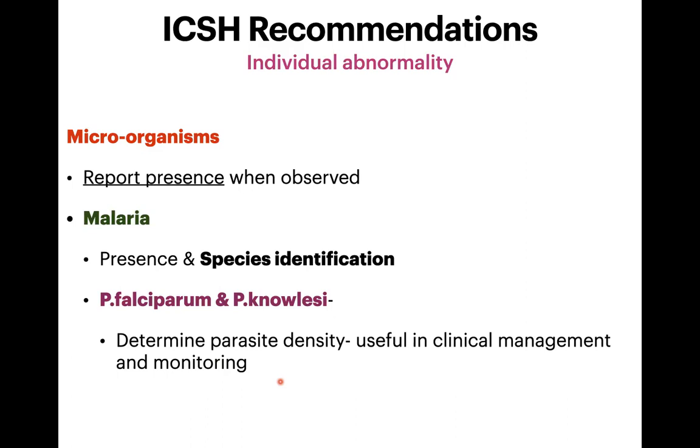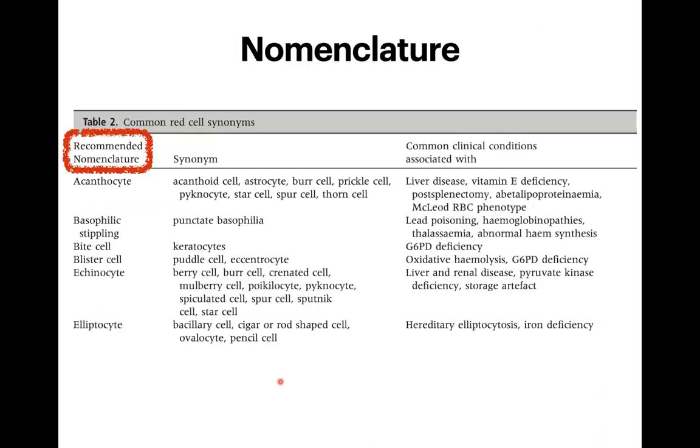In case of Plasmodium falciparum, it is important for the management, because they usually have a high level of parasitemia, and a high level of parasitemia is obviously the higher risk.